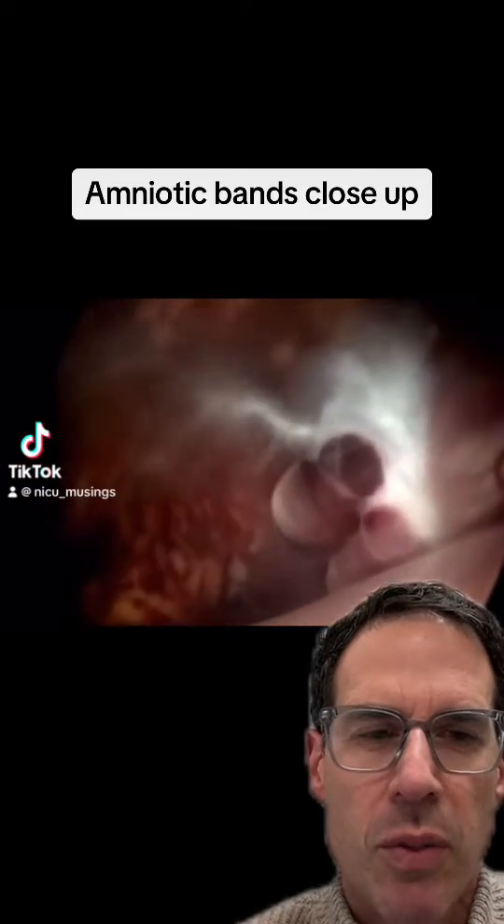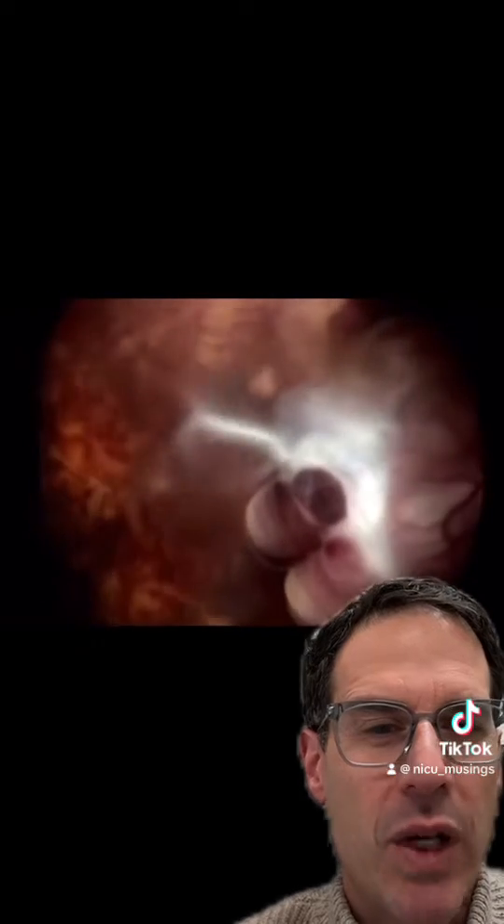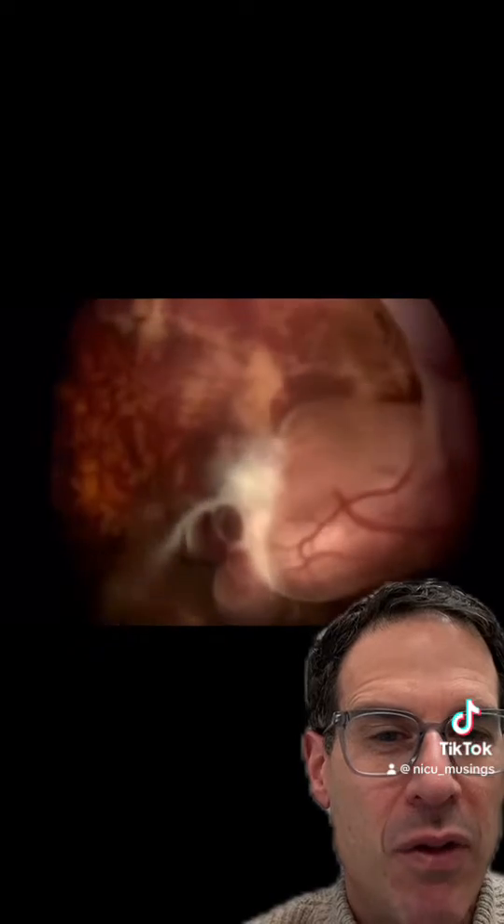Through the magic of a fetoscope, you're looking at an amniotic band. You can see that white wispy material, which is the amnion — the innermost layer of the membranes surrounding the fetus.